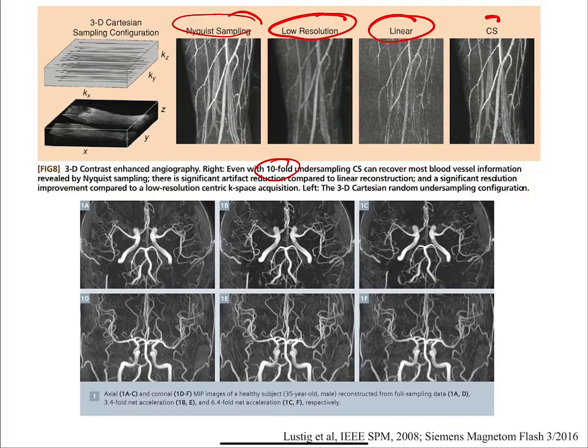If you use compressed sensing, then it does a remarkable job of recreating what the image should be. So much so that you think it must be cheating, but it's not. This has been verified many, many times.